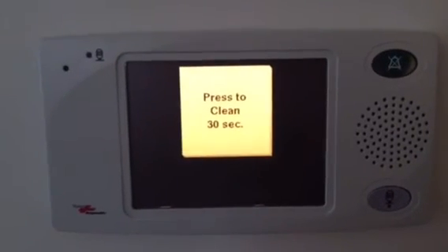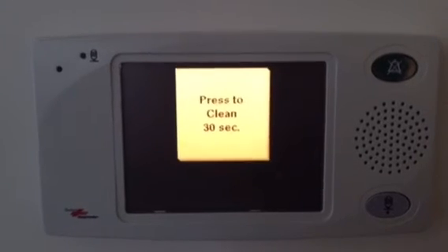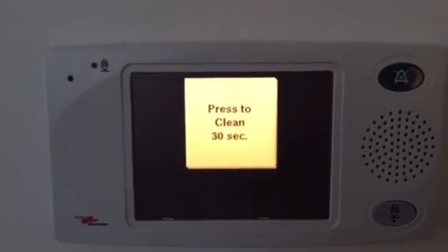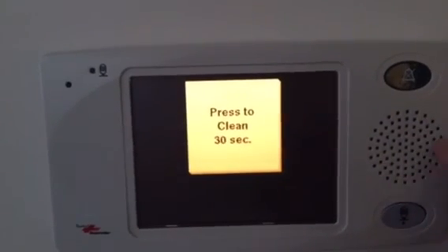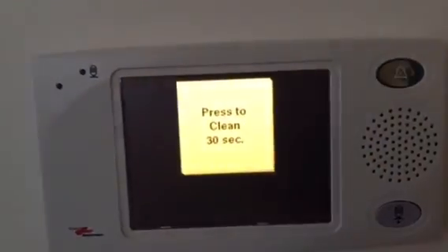The most important thing to remember here is that anything that you start on this screen, you have to stop on this screen. So if I hit a code blue or a medical emergency from this screen, I would have to hit it again to stop it. Hitting this button simply silences the alarm coming out of this speaker. It does not end the call. I have to hit the same button again to cancel it.